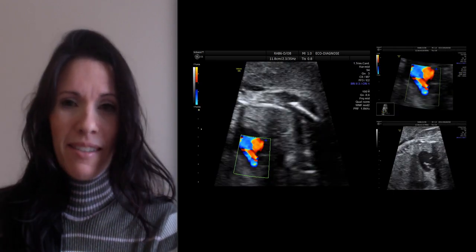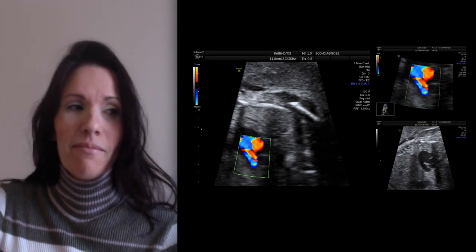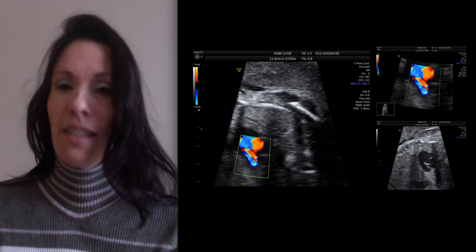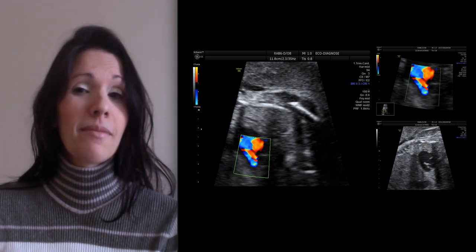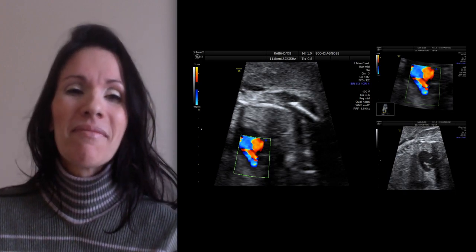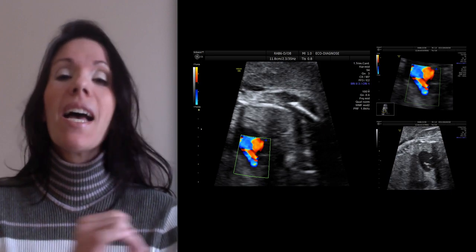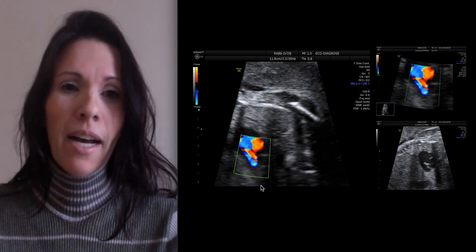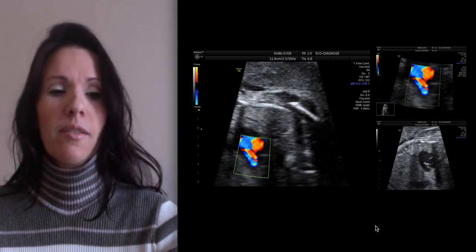And yesterday I got this image because the book, I love that book, okay? I love Rabinowitz as well. It's probably the weather. Even my voice is not normal. But okay, here I could see, come back.